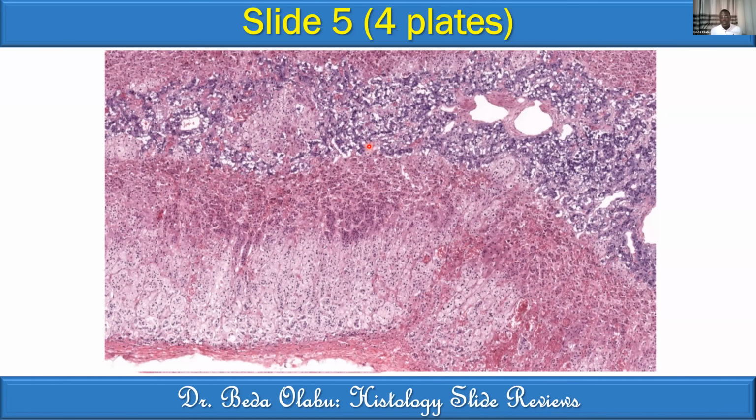Okay, I've given you 3 magnifications intentionally. So for this one, I would want somebody to describe it in those 3 levels. And after your description, give us an identification. Tell us now, based on what I've said, I think it is this organ or this gland.